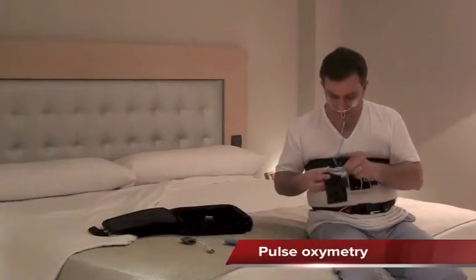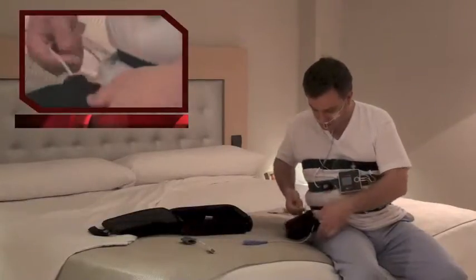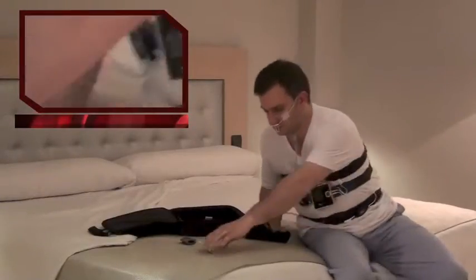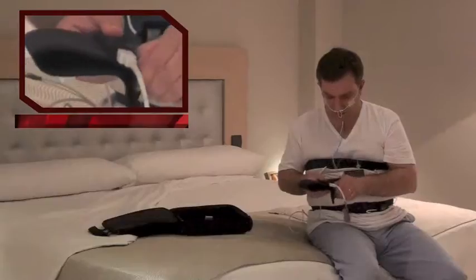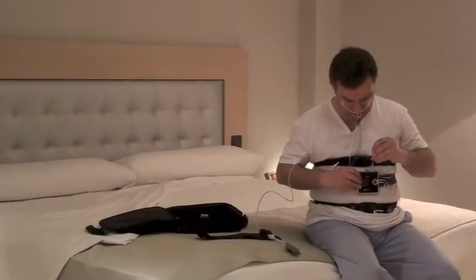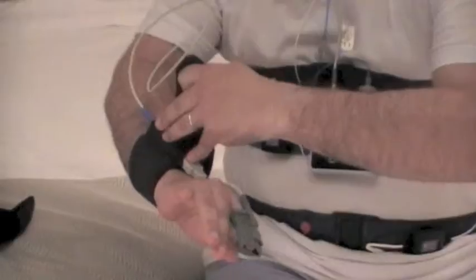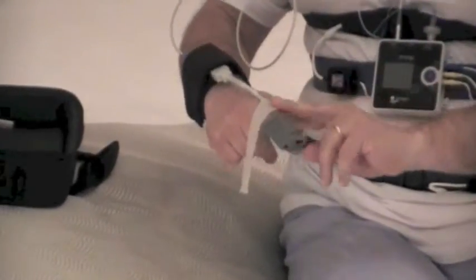Place the wristband and introduce the X-Pod in the pocket. Connect the larger end of the cable to the SPO2 entrance and then the sensor finger clip to the X-Pod. Secure the connection with the adhesive tapes crossing them over the pocket. Introduce the index or middle finger in the sensor without standing out. Fix the cable with surgical tape. The pulse oximetry sensor will allow us to evaluate the oxygen saturation in the blood and heart rate.